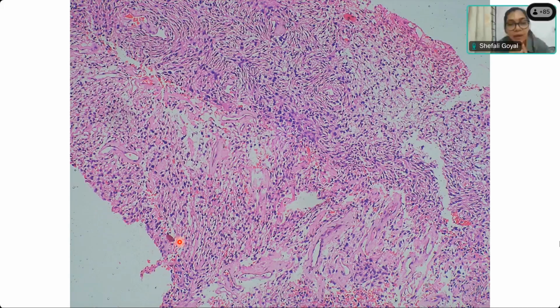From the given biopsy, the pattern looks very whorled in appearance. The spindle cells are arranged from the center like spokes going around. Yes, storiform pattern. Excellent, partly so. It is actually a storiform pattern. Very good, that's a very good observation. So it's a spindle cell tumor showing this very nice storiform pattern.